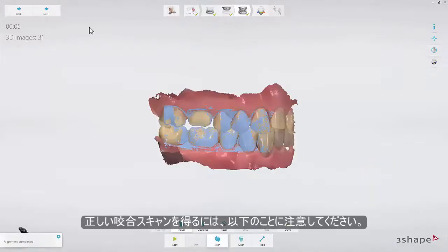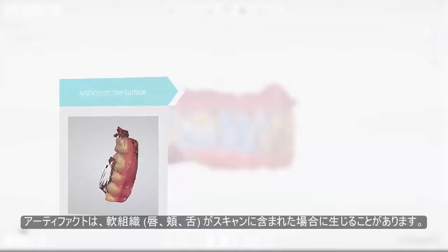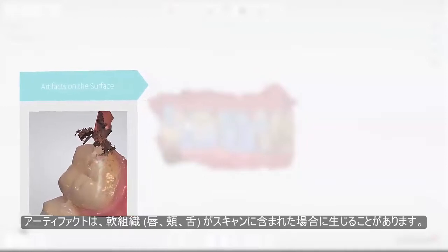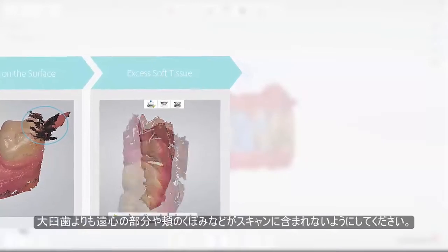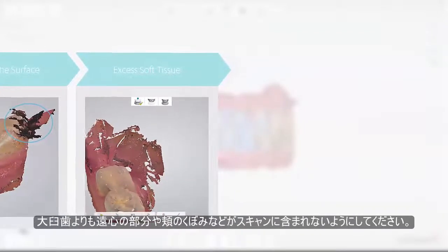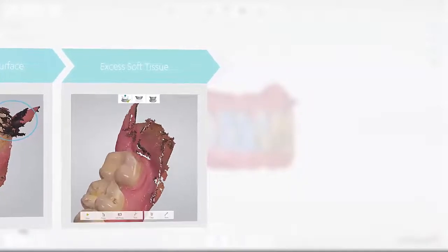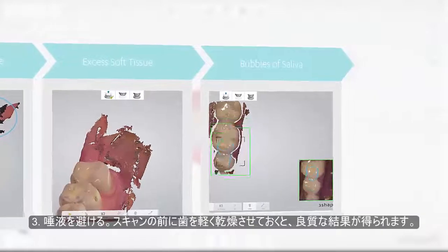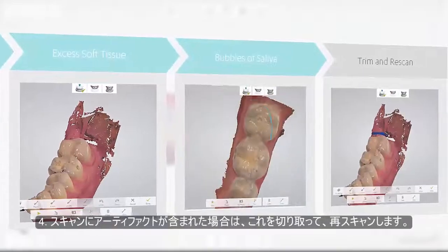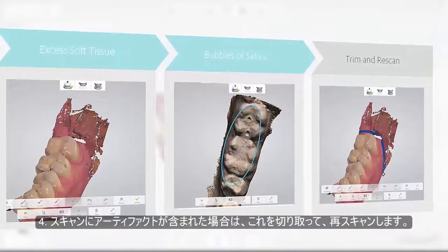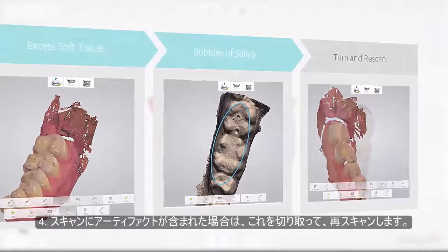When scanning the arches, there are a few things that will help you obtain the correct bite. 1. Avoid artifacts on the molar surface — these may result from soft tissue, lips, cheek, or tongue being scanned onto the teeth. Fix this by retracting soft tissue from the teeth while scanning, using for example a dental mirror. 2. Avoid excess soft tissue at the back, distal of the last molars or large portions of sulcus to the cheek. 3. Avoid bubbles of saliva being scanned onto the occlusal surface — dry the teeth before scanning. 4. If you accidentally scan any of the mentioned artifacts onto the teeth, simply trim away the artifact and re-scan that area.